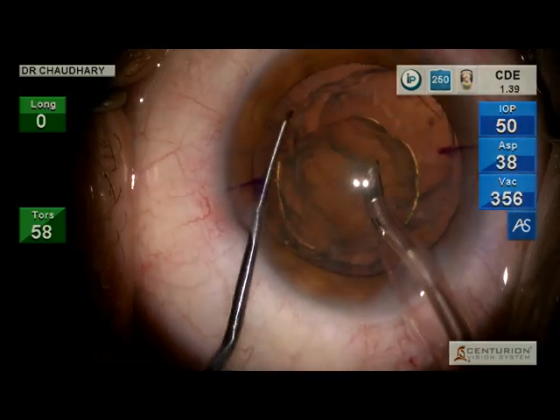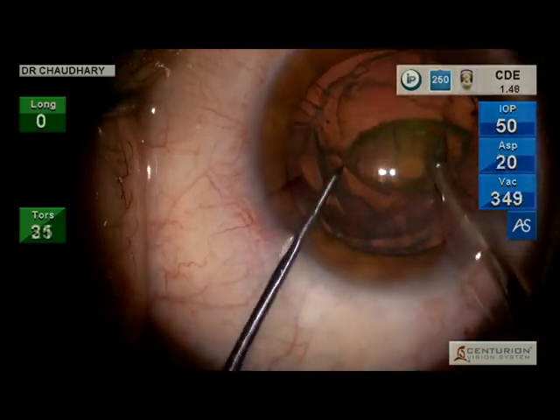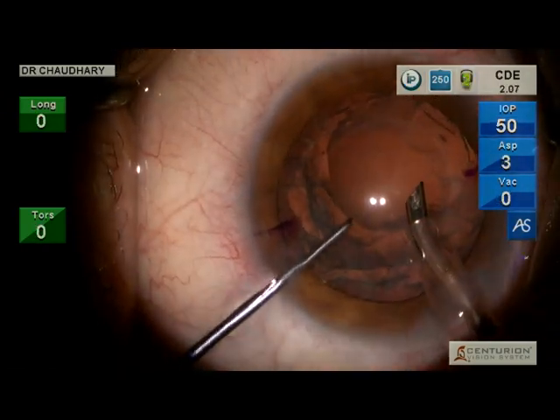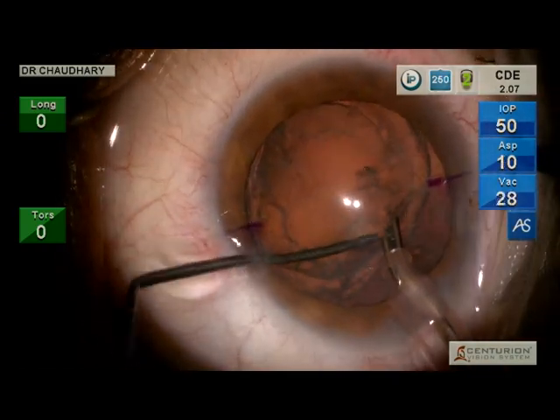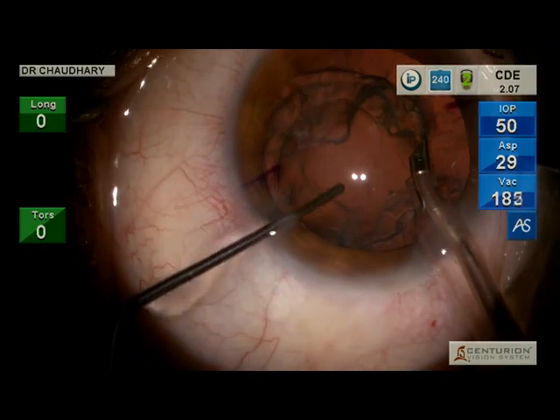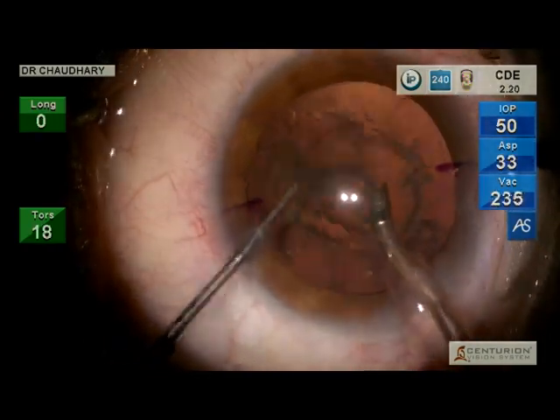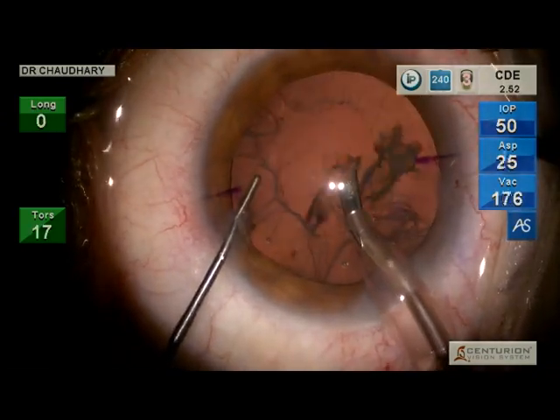This is maximum utilization of FACO energy, and what you see is the whole nucleus and epinucleus segment out of the eye in less than a minute, with the FACO energy peaking at just 2.6 CDE.